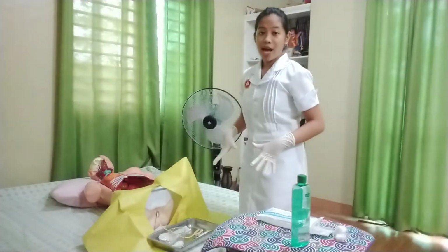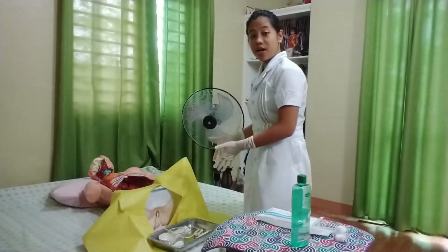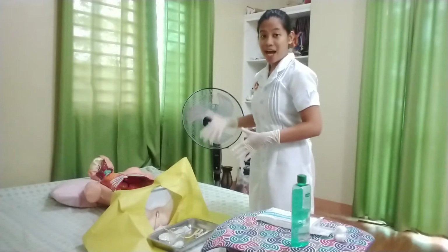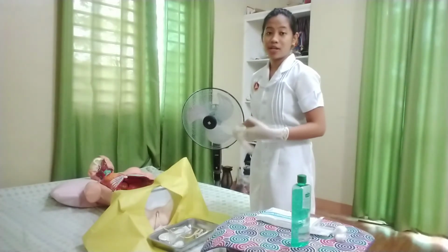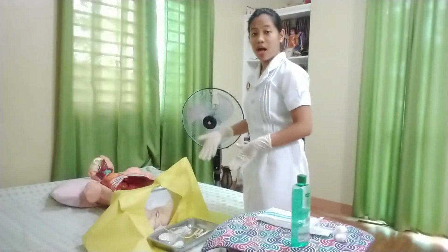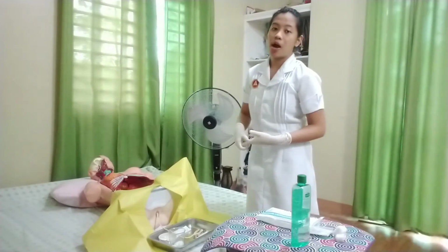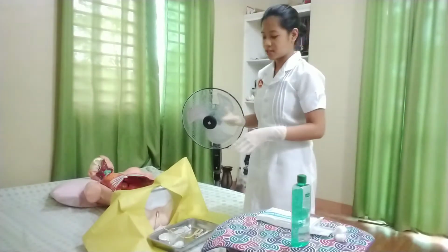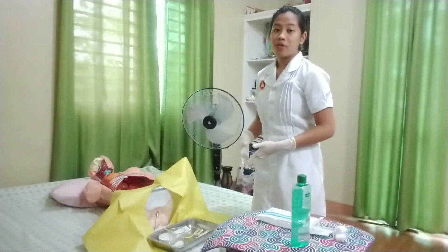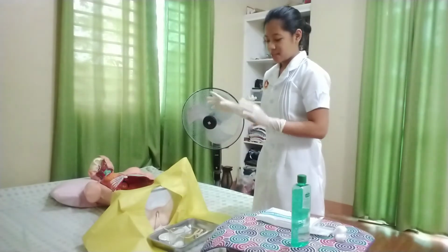Then after that we will secure the catheter and the tubing on the upper thigh using a velcro strap or a tape, and we will leave some slack in the catheter to allow leg movement. And then we will also be checking the drainage tubing if it is not kinked, and whether the movement of the side rails will interfere with the drainage bag and the catheter.